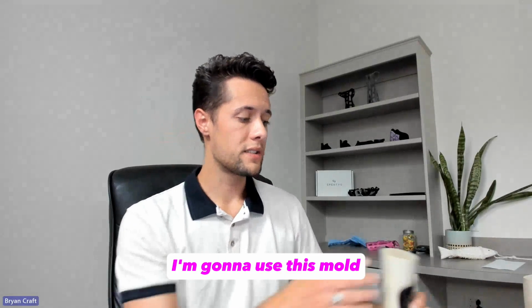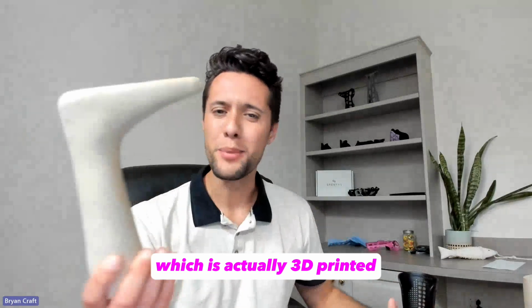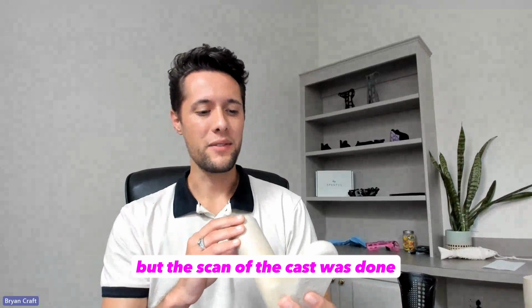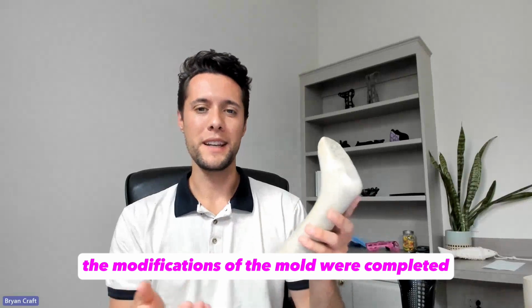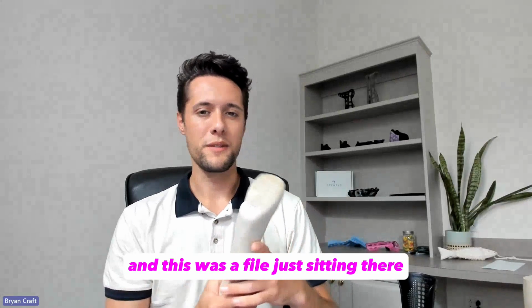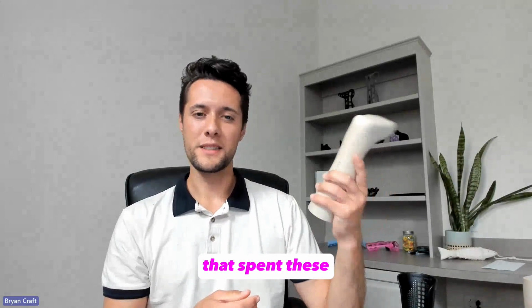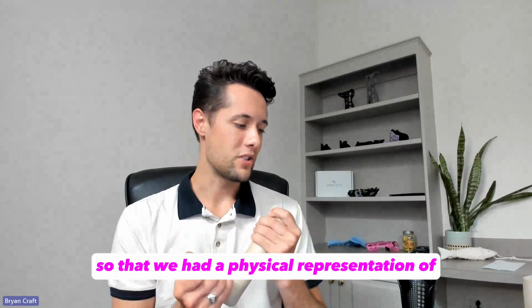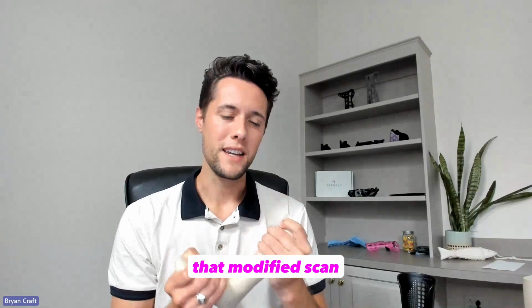And I'm going to use this mold, which is actually 3D printed. So not carved, not poured, but the scan of the cast was done. The modifications of the mold were completed, and this was a file just sitting there that Spentys then 3D printed so that we had a physical representation of that modified scan.